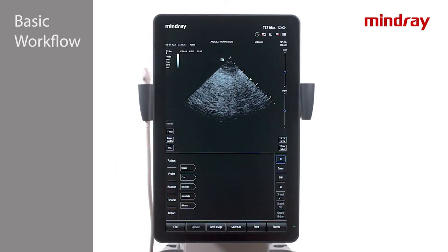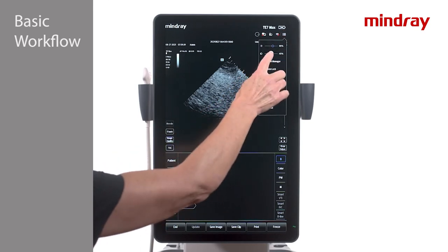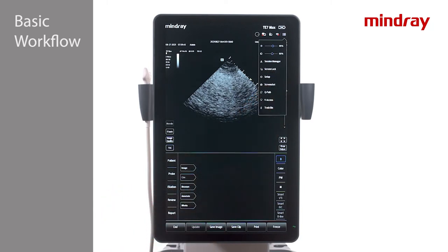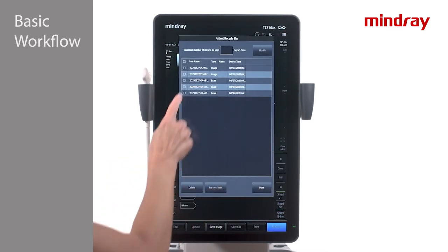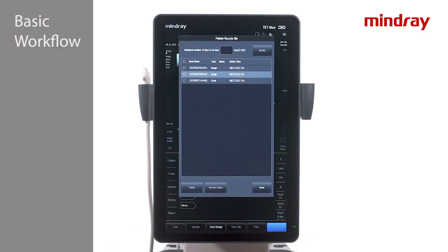Further to the right is the menu icon. Located here are the monitor brightness and contrast controls, the screen lock — which allows the screen to be locked for 10 seconds for cleaning purposes — and the trash bin, where deleted exams and images are stored. Delete unwanted items manually or the system can be set up to purge them automatically. An application specialist will help configure this feature.